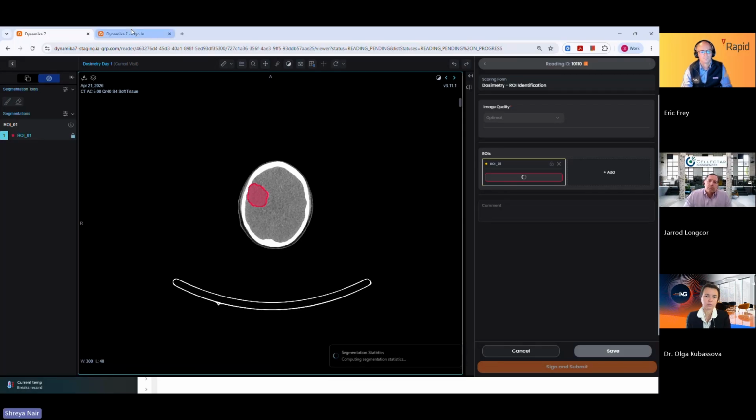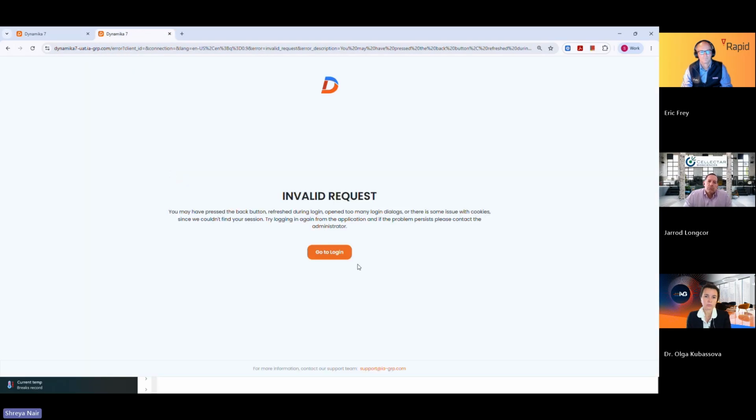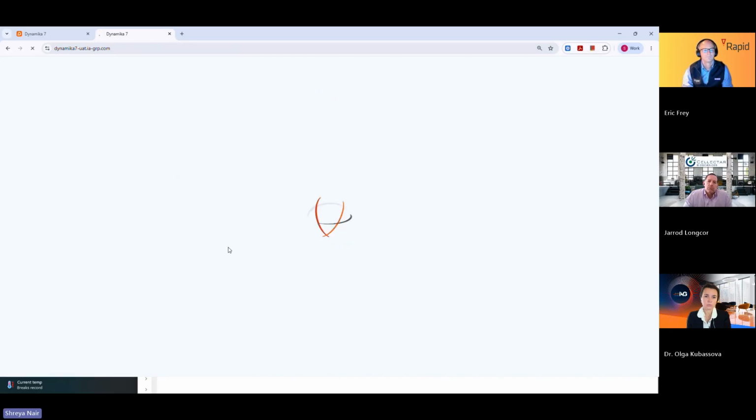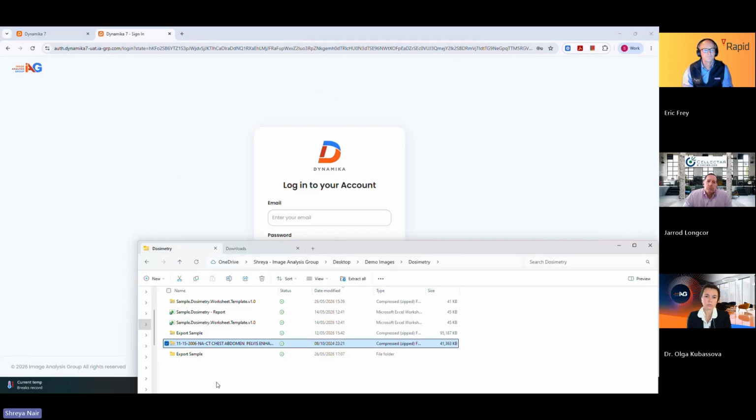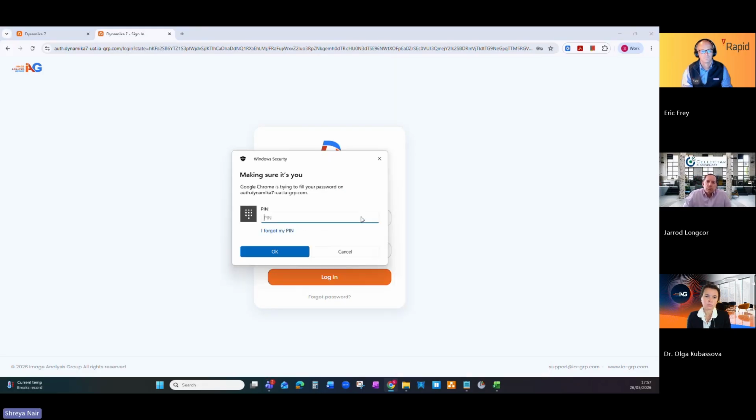And as I mentioned, I can quickly also show you how the exports can be accessed. So for example, I'll log in as this other user role. We call this the external user role. And this is where they would ideally log in and export out all this reading information, the miscellaneous files for further analysis. So let me just log in as this user.